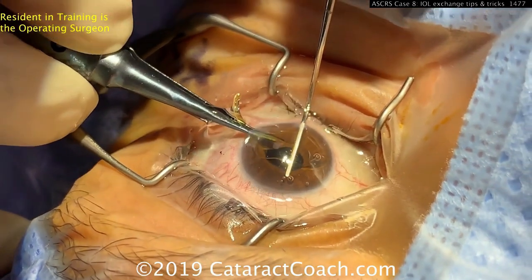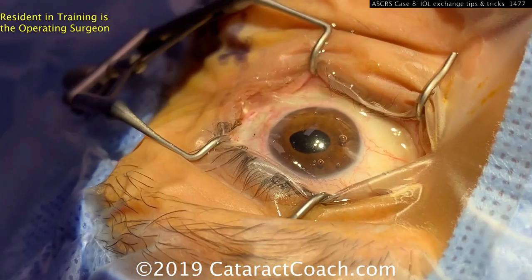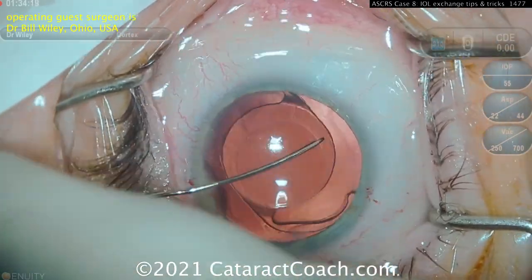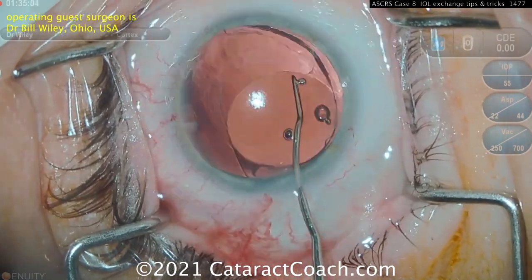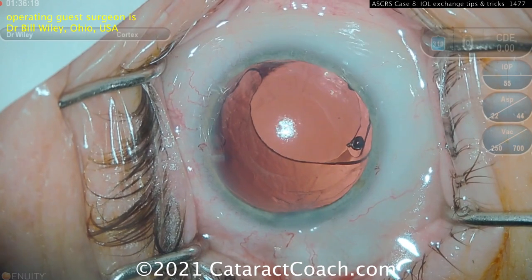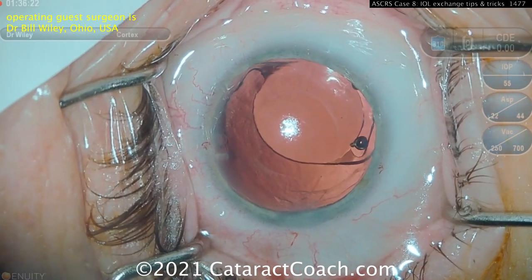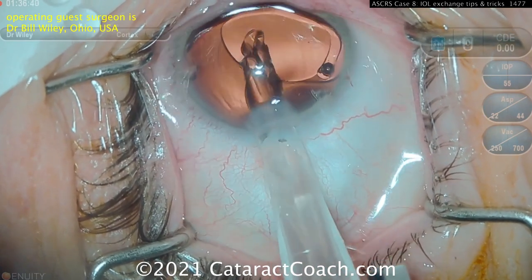Here's an external view of the same thing: grabbing it, twisting it, spatula to help, and pulling it outside the eye. You can also do what Bill Wiley does here — un-inject the lens. He frees the lens out of the bag into the anterior chamber, then puts the new lens inside the capsular bag to protect it. Here comes the desired new lens.